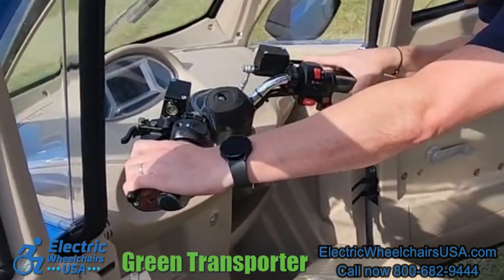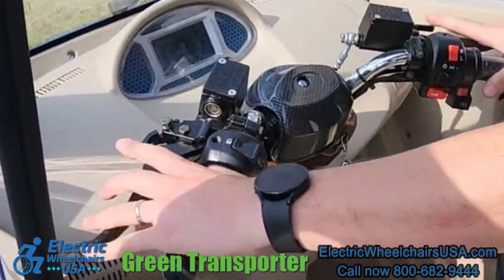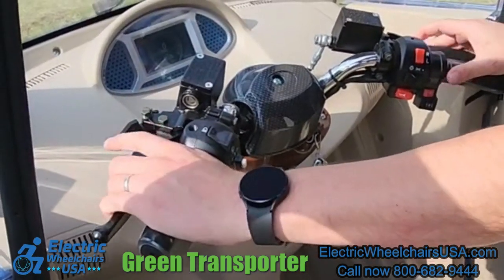To brake the Q-Runner you have to use these two hand brakes. It does not have electromagnetic brakes, so that's something to keep in mind — you do need to have dexterity in your hands in order to brake the unit.